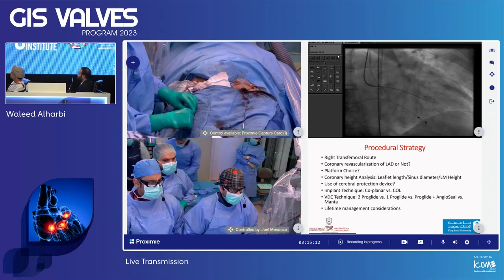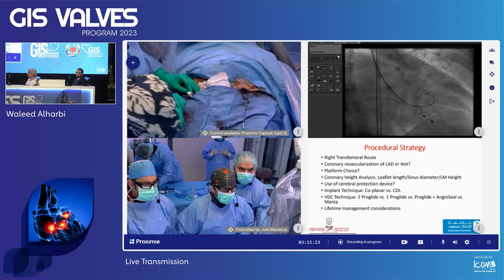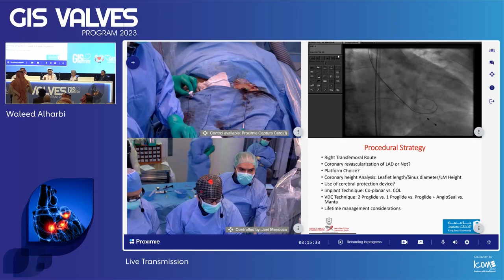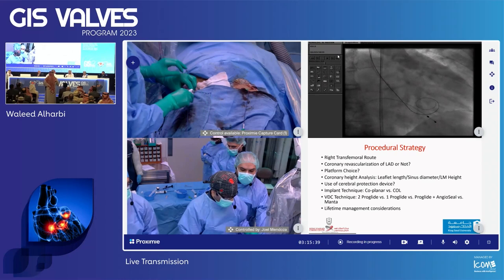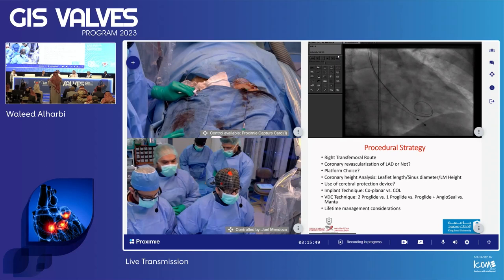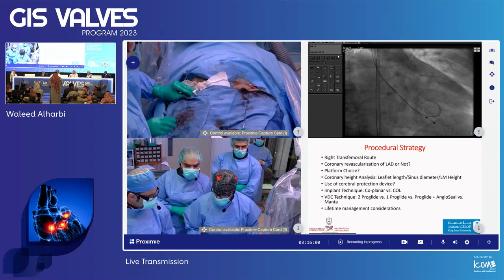I see you are using transvenous pacing here, which I understand in the context of an Edwards valve. A question to the panel: I keep hearing that a self-expanding valve is chosen because the coronary height is 10.4 mm. Why is the left main height dictating valve choice? Also, the annular area is around 380–400 mm², placing this in the small annulus category — is there discussion about valve choice related to small annulus?